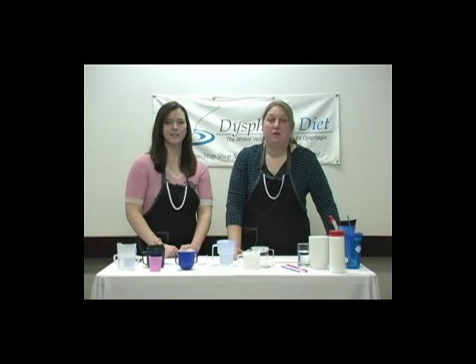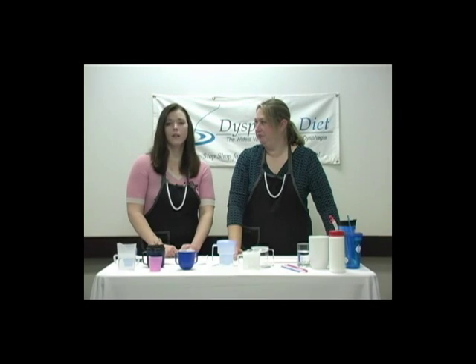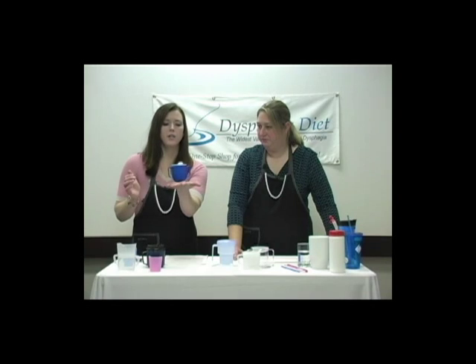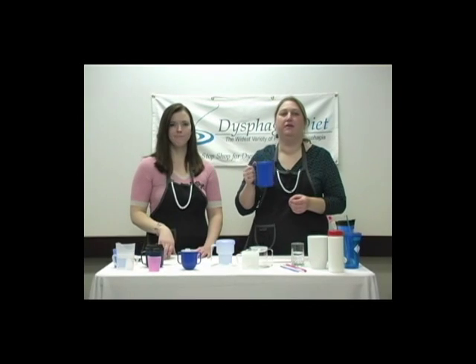There are lids with small openings to control the flow of liquid. There are also lids with spouts and lids with openings for straws. And the tippy cup will stay upright, so somebody that's unsteady or shaky can easily set it down without worrying about their drink tipping or spilling over. Just like a Weeble Wobble. Exactly. This is a wedge cup.